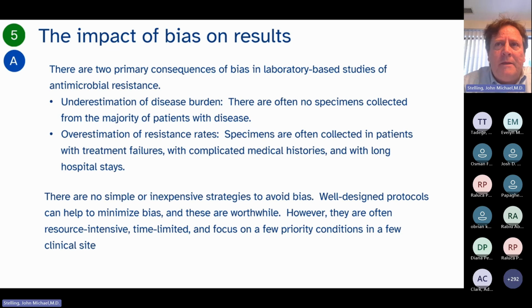We have to keep in mind that in most typical circumstances, laboratories have routine samples. In a human clinical lab, in a veterinary diagnostic lab, we don't get the results from all patients and all animals.